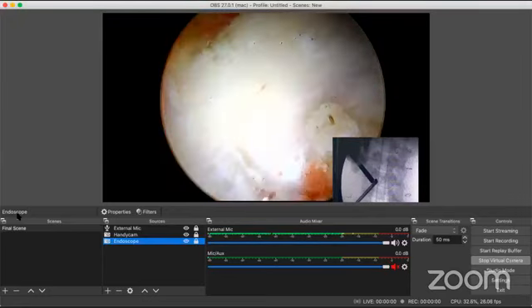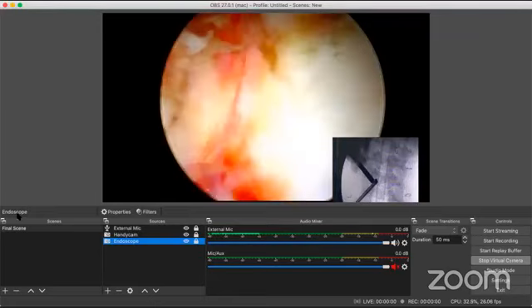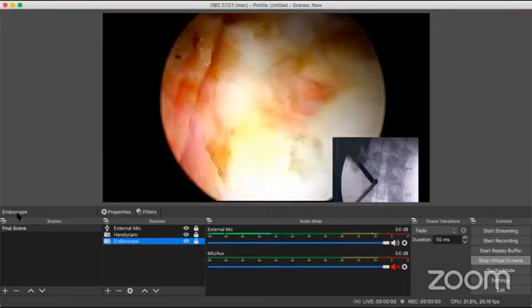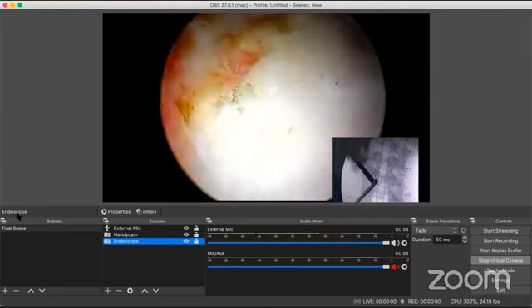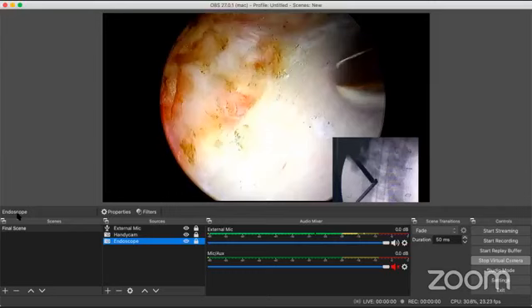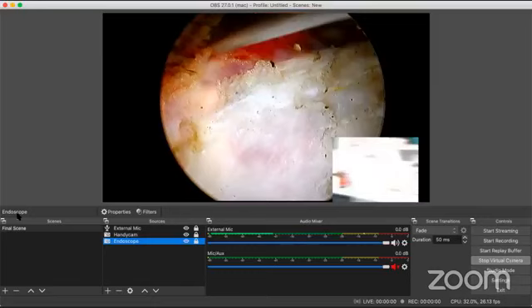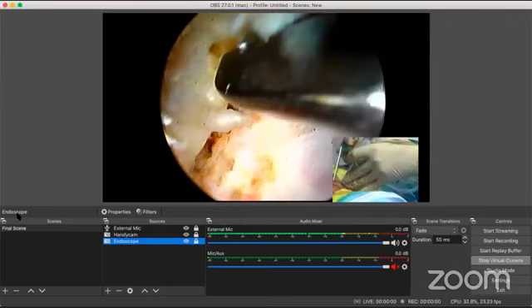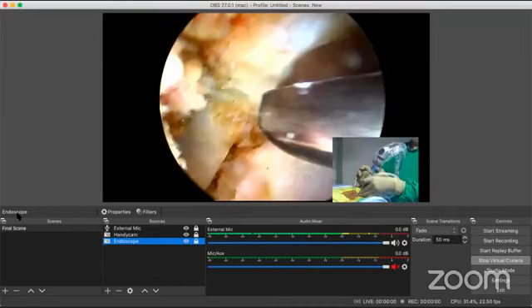Machine back. I don't need the machine anymore. Back machine, please. Thank you. Now, what I'm going to delineate and show you is, this is the superior edge of the inferior lamina. Okay, this is the central area. And this is the lower edge of the upper lamina. You are coming almost up here to the center interspinous zone.